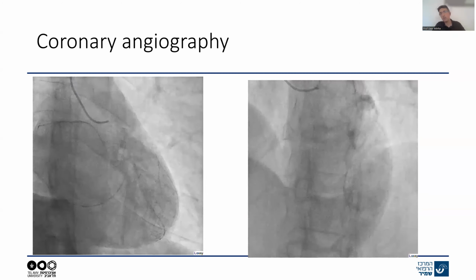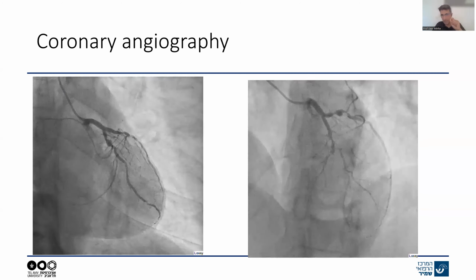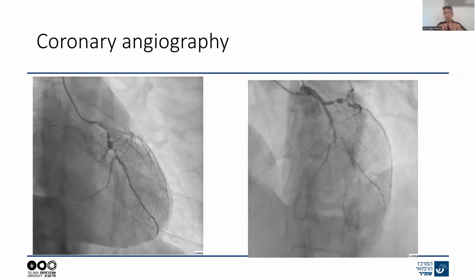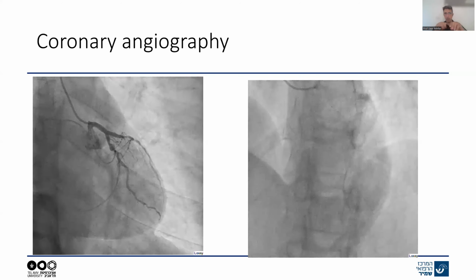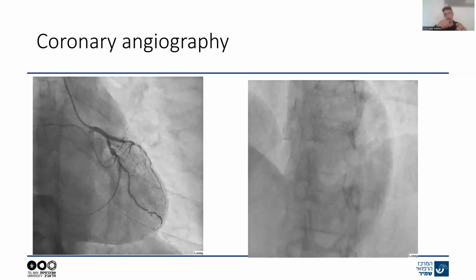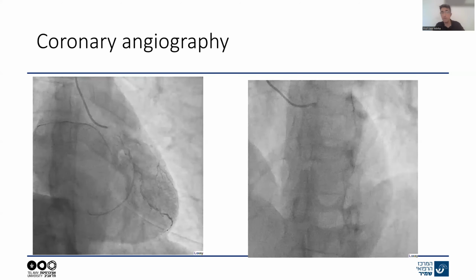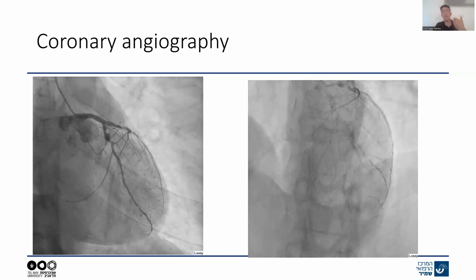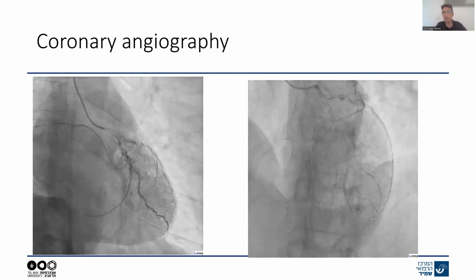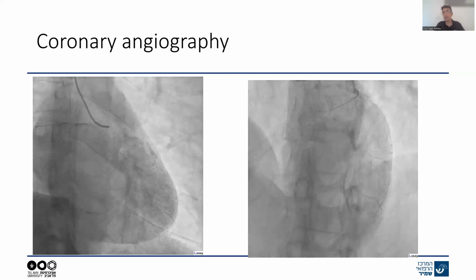For that, every second includes 15 X-ray images. You remember as kids, at the end of our books or notes in school, we were making a little movie by taking a few pages and doing some little drawings and changing the drawings just a little bit to see that as a movie. That's exactly what we see here. So in order to see the flow live, we use X-ray continuously. We provide energy all the time, between 7.5 to 15 images per second. So that's a lot of radiation.